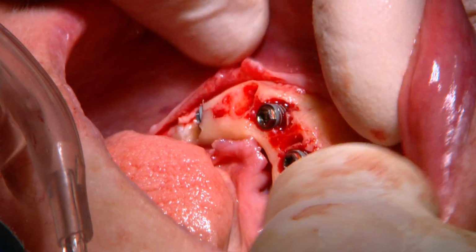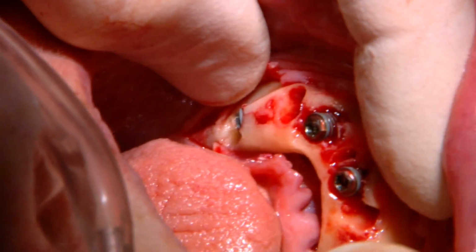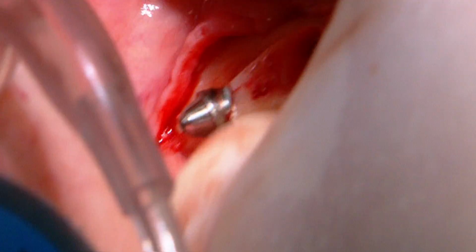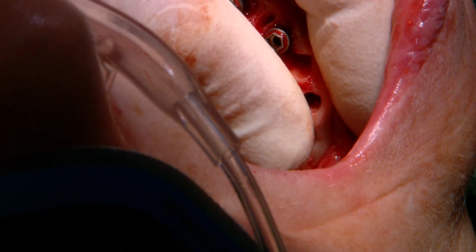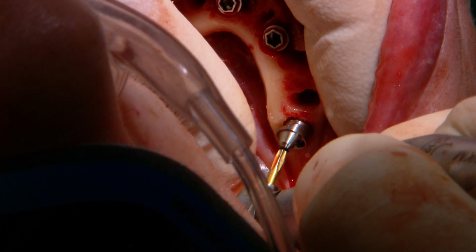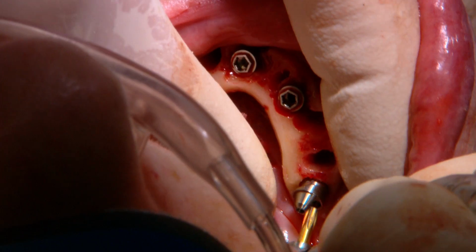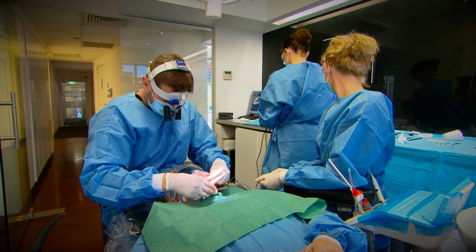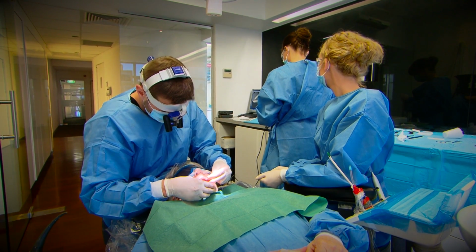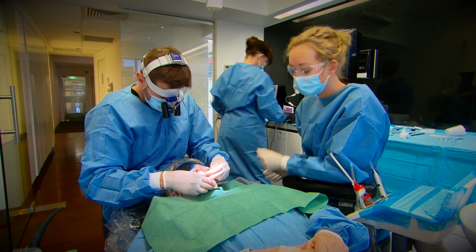So you can see now the implants are placed. They're all at the same level. The next stage is to connect the connectors to the implants. We call them the abutments. We're using 17-degree abutments because we want to throw the screw hole back and just towards the end, so it goes through the centre of the teeth as we tried in with the surgical guide. We often use 30-degree abutments, but we're using 17 here because we don't have a lot of space back here.